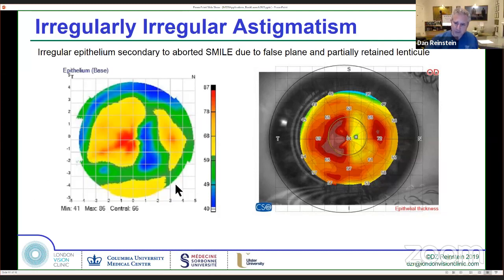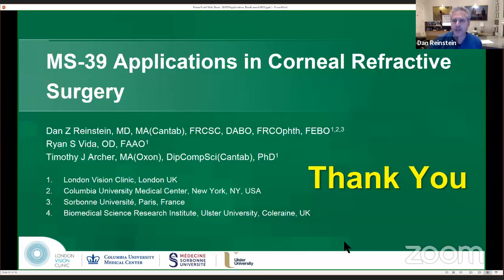I mean, obviously we have a 10 millimeter zone. It's OCT, so it can't get the whole periphery, but the center is where the information is that I need. And I can make surgical decisions about transepithelial PTK and how much tissue I should remove and from where. And I can also make predictions about the refractive shift that I'm going to expect after this transepithelial PTK, just from one device.